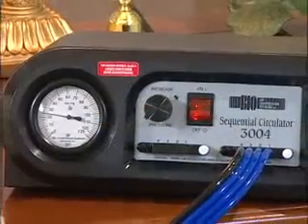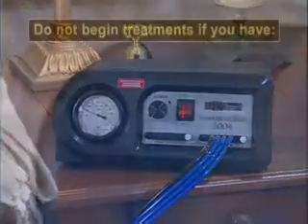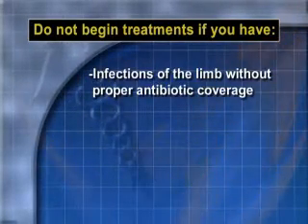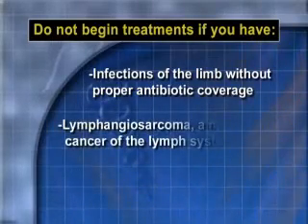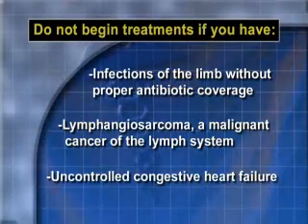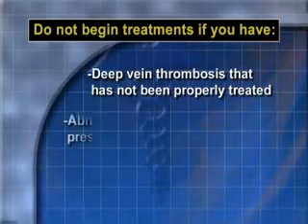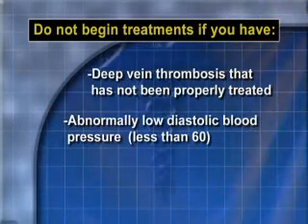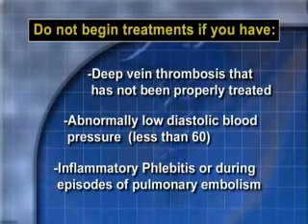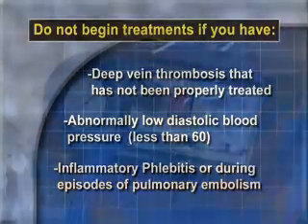Before we show you how the pump works, we want to make sure you don't have any medical conditions that would prevent the use of the system. Some of these conditions would include open infected wounds of the limb which have not been treated with appropriate antibiotic coverage, the presence of lymphangiosarcoma, a malignant cancer of the lymph system, uncontrolled congestive heart failure, deep vein thrombosis that has not been properly treated, abnormally low diastolic blood pressure, the lower of the two numbers, less than 60, inflammatory phlebitis, or during episodes of pulmonary embolism. If you have any of these conditions, contact your physician before using the system.